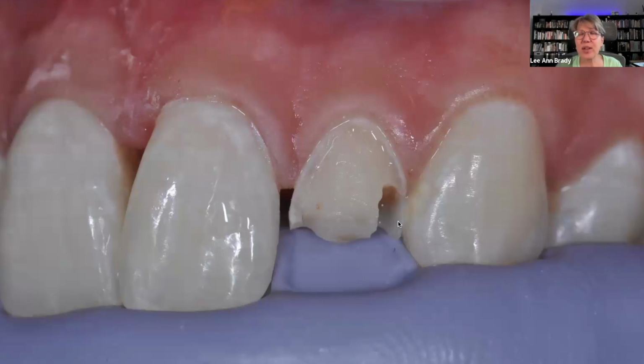And I don't feel like that's overly aggressive in this case because ultimately at some point in the future she's going to end up with ceramic restorations on these teeth. So these are, I hope, long-term composites, but at some point somebody's going to prep this tooth for a crown anyway.